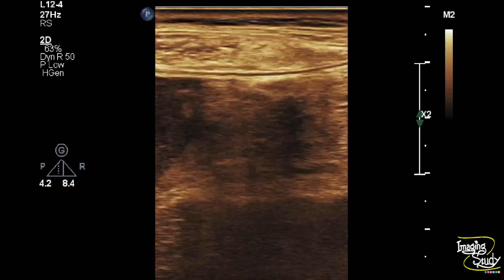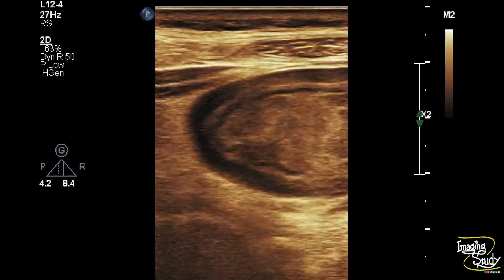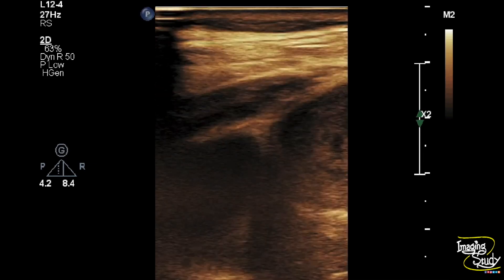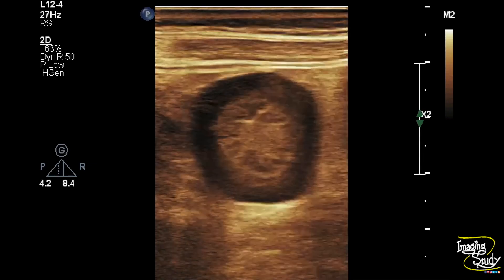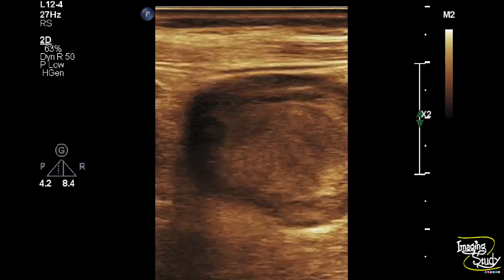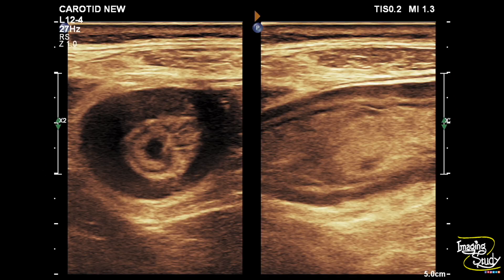So this is a case of gastric antral thickening, which is a very common feature in both benign and malignant conditions. Here is the picture of the transverse and longitudinal section of the antral region showing the hypoechoic wall thickening, and the lumen shows food particles.